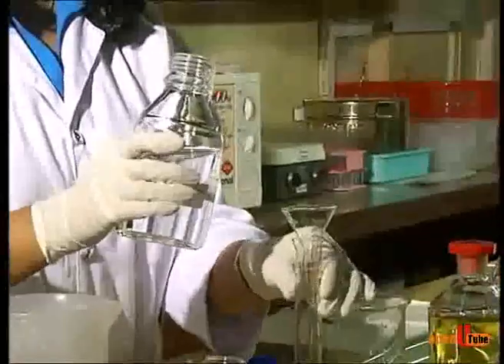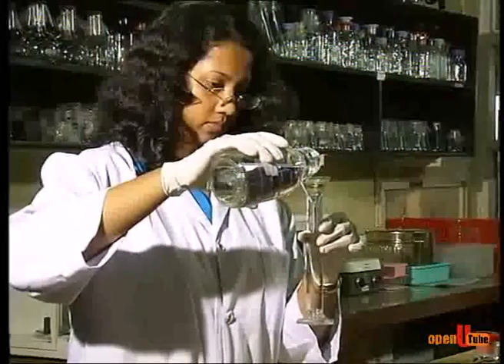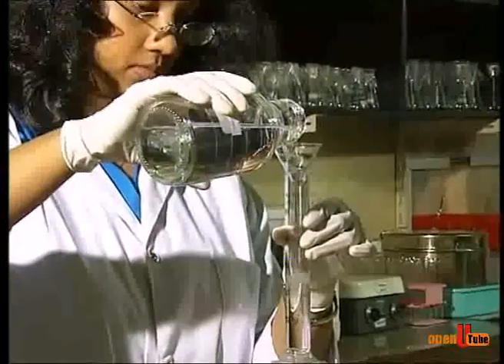Then measure the required volume of macro 1 solution into a measuring cylinder and transfer into the beaker containing 300 milliliters of distilled water.